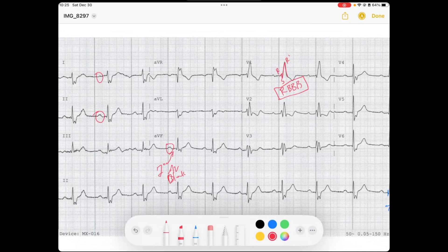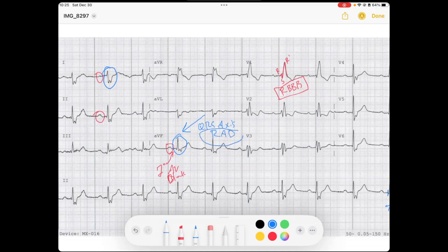So we've confirmed a right bundle branch block. I then look at the QRS axis: in lead 1 the QRS is negative, and in AVF it's more positive, meaning the QRS is directed down and to the right — that's right axis deviation. In lead 1 I've got a little r and big S pattern, and in the inferior leads I've got a little q and big R pattern. In the setting of a right bundle branch block, we also see criteria for a left posterior fascicular block.